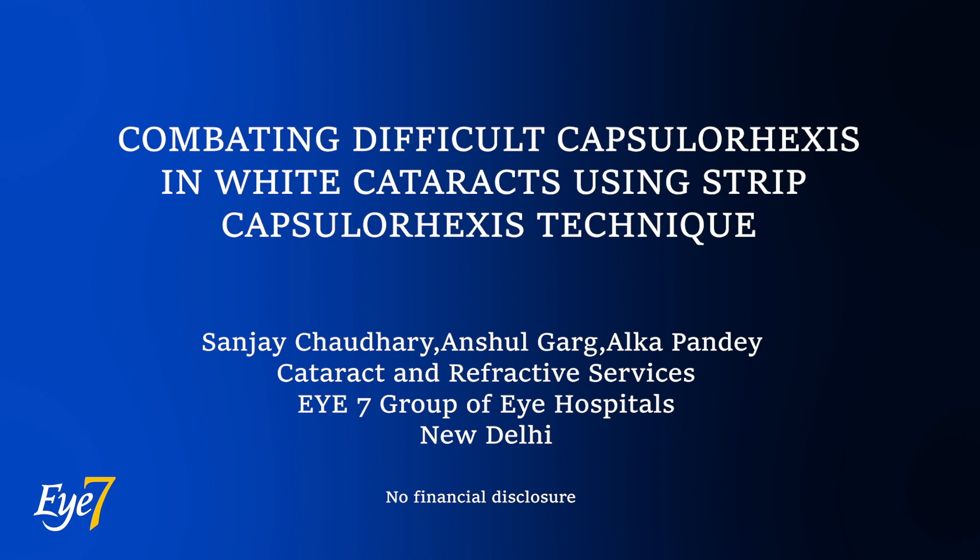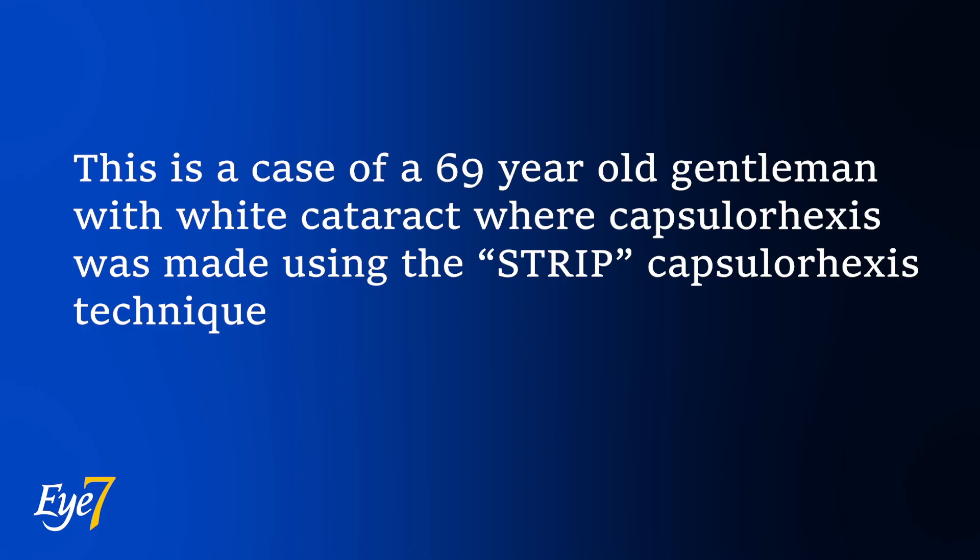Capsulorhexis in white cataracts is a challenging task, given the fact that the anterior capsule is thin and there are chances of the dreaded Argentinian flag sign. We present a novel technique of making continuous curvilinear capsulorhexis in white cataracts using the strip capsulorhexis method.